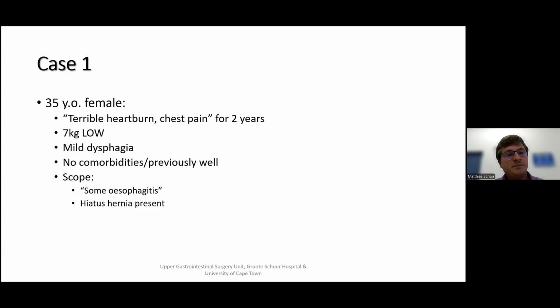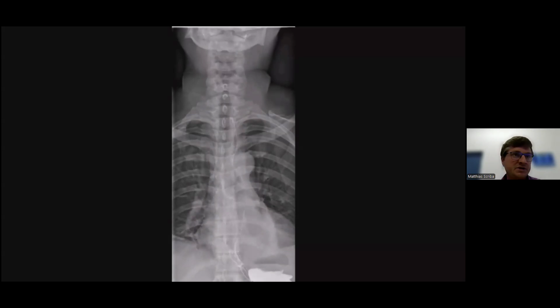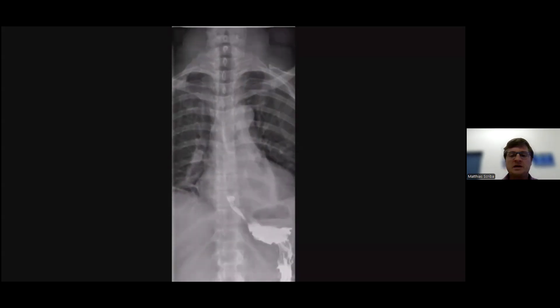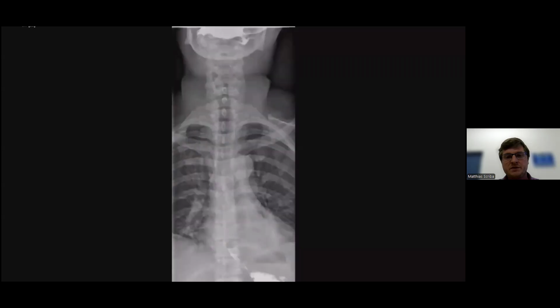Well, fortunately, the surgeon didn't just sharpen his knife and instead sent the patient for a swallow first. And I do think a barium swallow is an extremely useful investigation to do. If you don't have manometry, please at least do a swallow. And I'm going to run this again, let's just run it again.